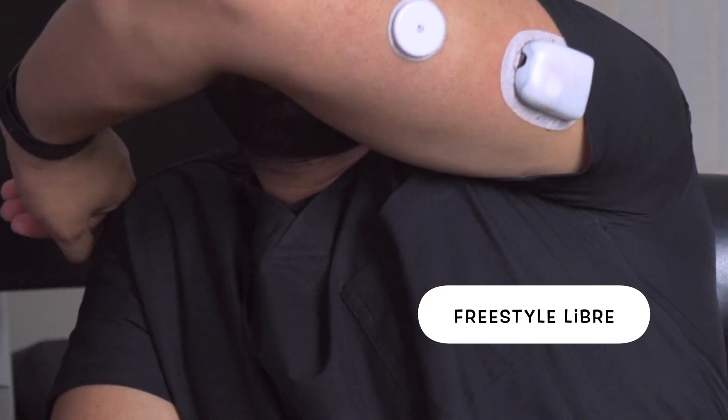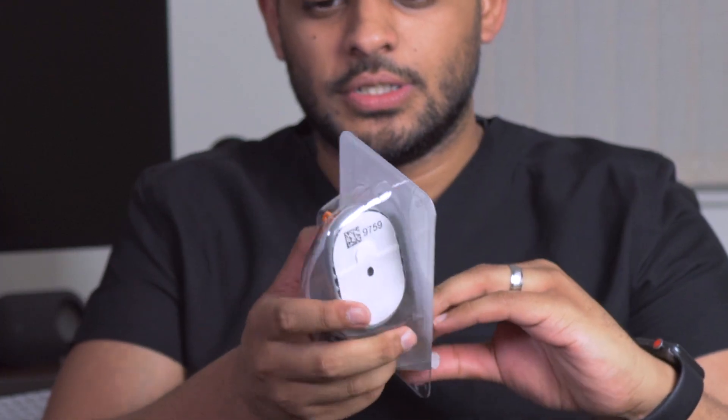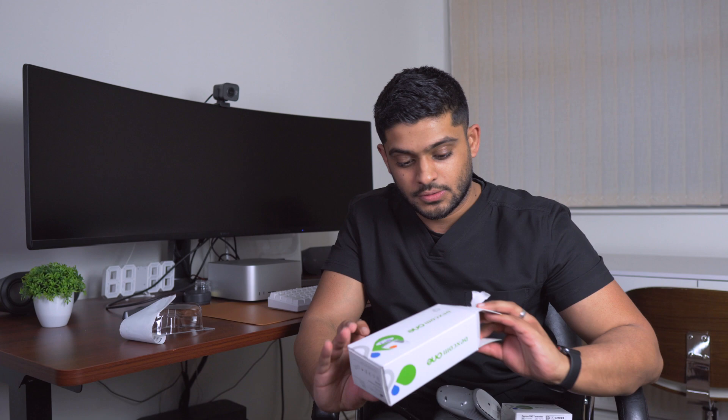This video is really going to be an unboxing — it's the first time I'm trying it out. I currently use a Freestyle Libre that you can see right over there. There's nothing on the box, but I was watching a video earlier, so let's try putting the sensor on.